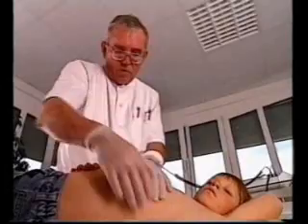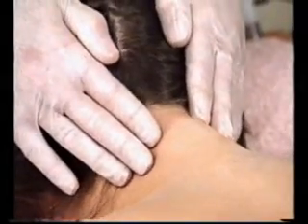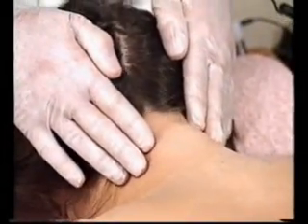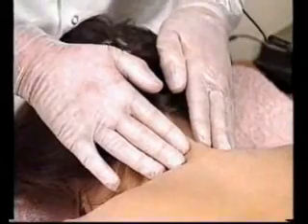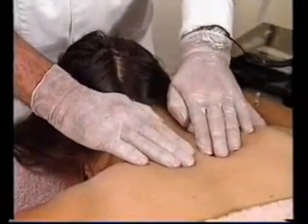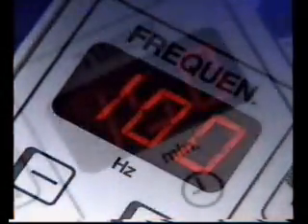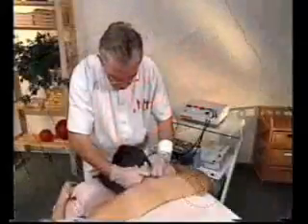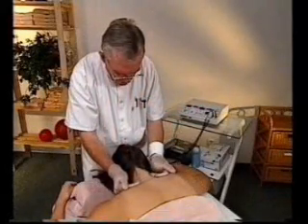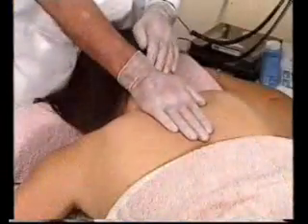One of the main advantages of deep oscillation by the Hivamat 200 is that of the analgesic and detonizing effect, occurring even with minimal mechanical action, that is, treatment pressure. This opens up the possibility of treating acute cases and patients with highly sensitive pain conditions, such as whiplash injuries. Due to deep oscillation, the recovery of the micro and macro trauma shortens decisively.